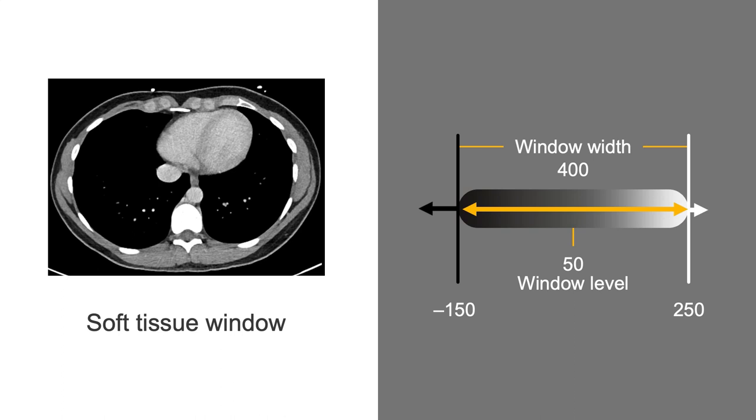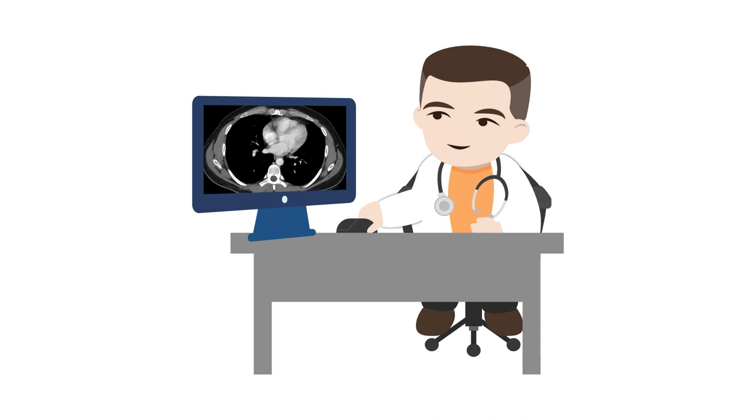The specific settings in the soft tissue window help us to see relatively subtle but important differences in enhancement or densities of structures like the liver, spleen, pancreas, and kidneys, which help us diagnose different diseases.